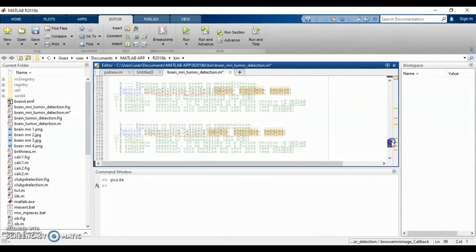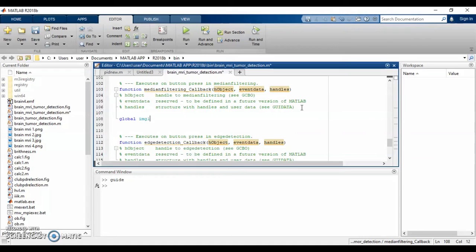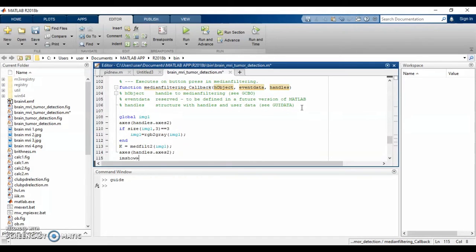For the second push button, we will use the function median filtering to remove noise from the image. We will need to type the command global to retrieve the image that we previously used, and to show it in the second axis, we will need to type handles.axes2. So before applying median filtering, we need to convert the image to grayscale image by typing the command rgb2gray, and then we can apply the median filtering function. And next, we will finally label the image as median filtering with the font size of 20 in purple color, and we will show the image by typing imshow command.